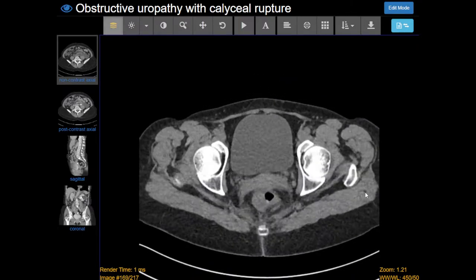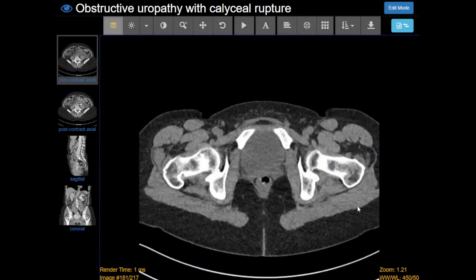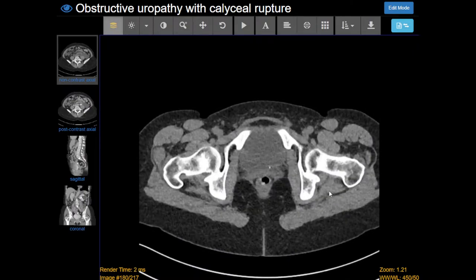Keep going down. Difficult to see, but if you know the anatomy, you know that the ureters insert on the posterior inferior portion of the bladder, so I'm a little worried about this calcification right here. It's only one or two millimeters, but it's right at where I would expect that ureter to insert into the bladder.